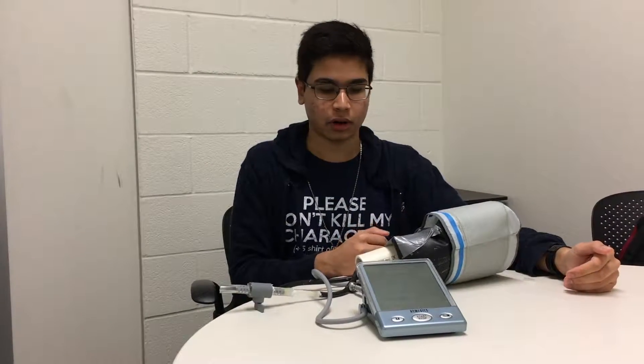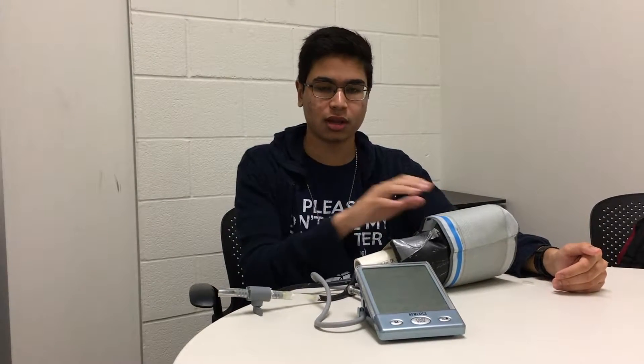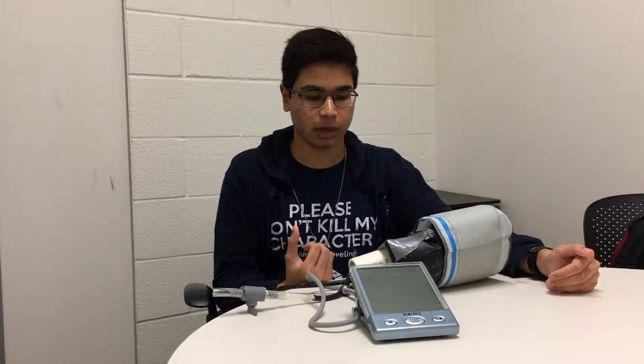Here we have a blood pressure monitor. It is attached to a cuff which wraps around your arm and measures your blood pressure. Our prototype is a simulator which simulates your arm in order to trick this monitor and this cuff into believing that it is an actual human arm for the purposes of blood pressure.